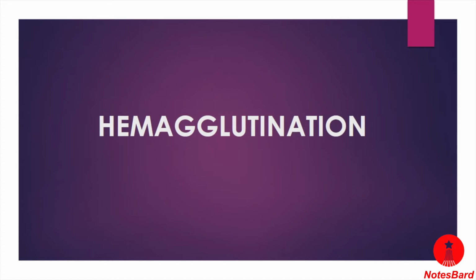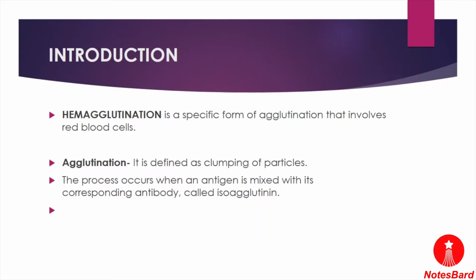So in this video lecture, we will discuss the phenomenon of hemagglutination. So now let's start with the introductory part. Basically, hemagglutination is a specific form of agglutination that involves the red blood cells.